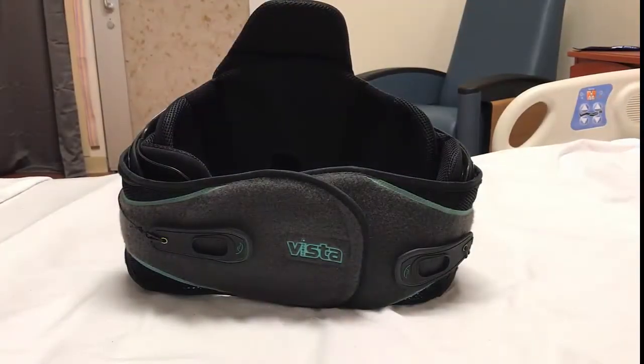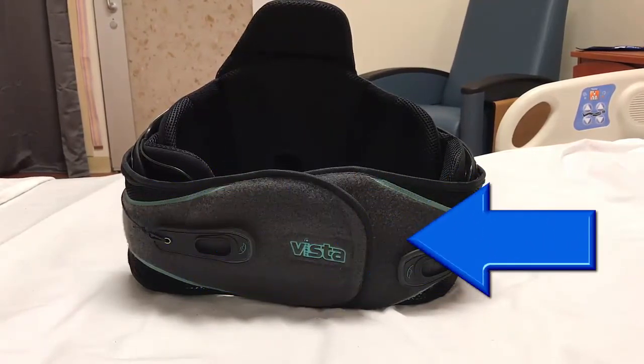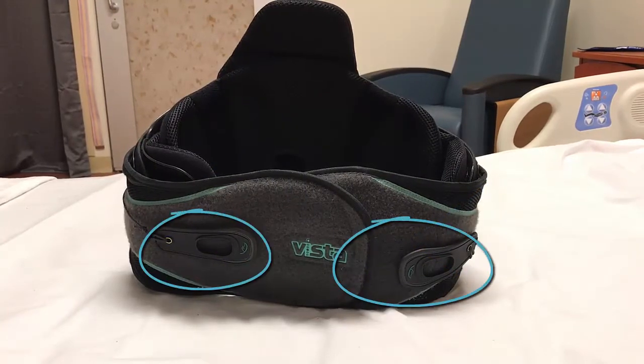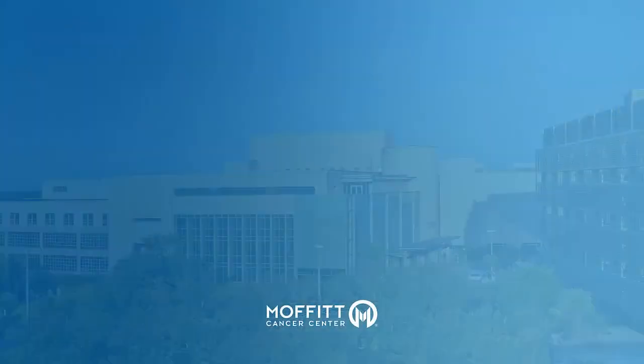This is the front of your low back brace. Notice the top flap on the right and the bottom flap on the left. Notice the adjustment straps on either side — they are velcroed in place and are used to tighten the belt. This is the back of your low back brace.